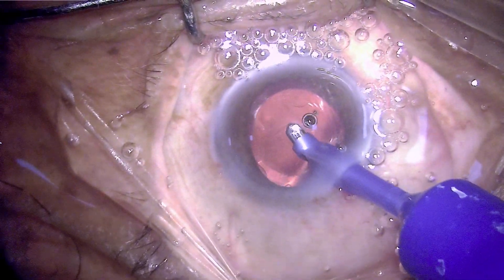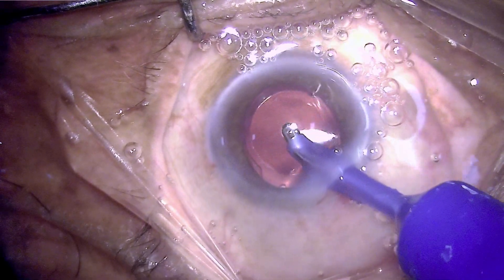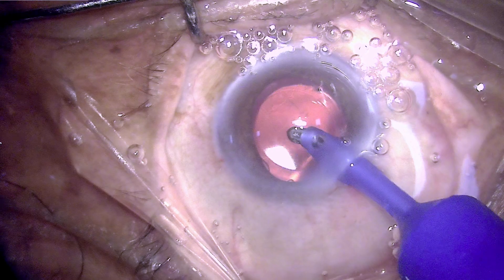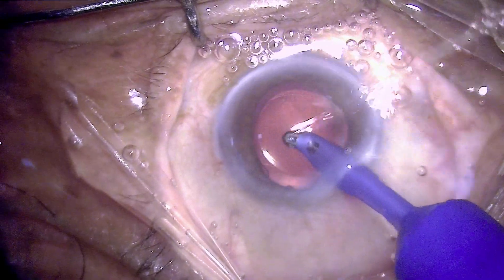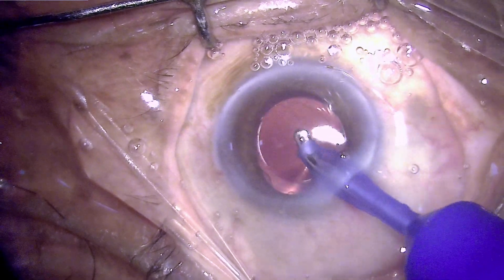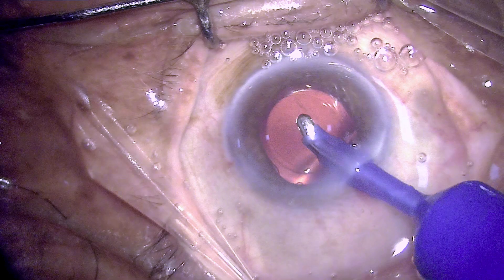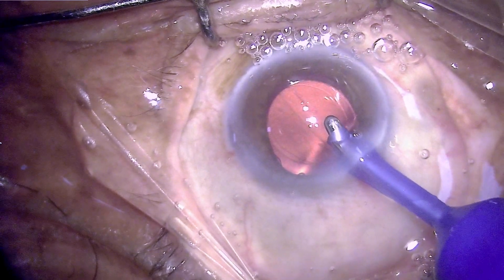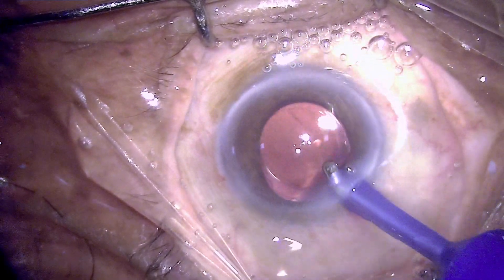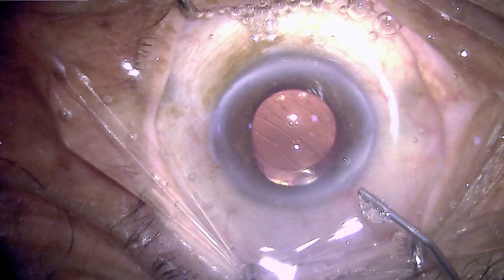Removing the viscoelastic gel — notice that we will have a posterior fluid wave which will sweep the viscoelastic gel trapped behind the intraocular lens. This viscoelastic may be a reason for next-day inflammation, and it is very important that the gel and cortex are thoroughly washed to avoid post-operative inflammation and corneal haze.